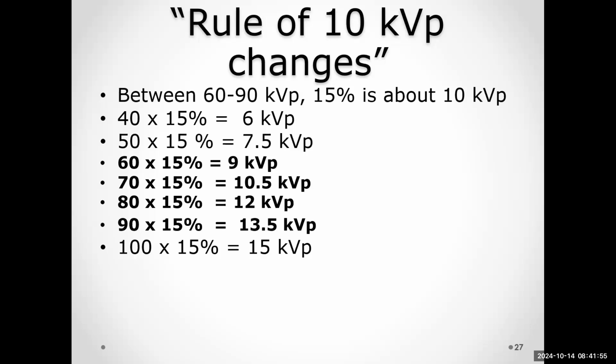Where does it matter if it's quicker? Yeah, like if you're in clinic, when you're actually doing patients. I know you haven't been in clinic yet, but you're going to see. You're not going to have time to sit there at the portable machine and do math, right? But you can add 10 and subtract 10, I hope, pretty quick, right?